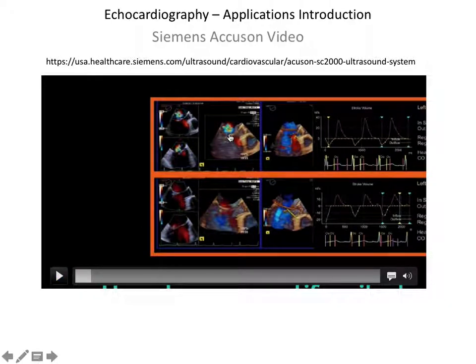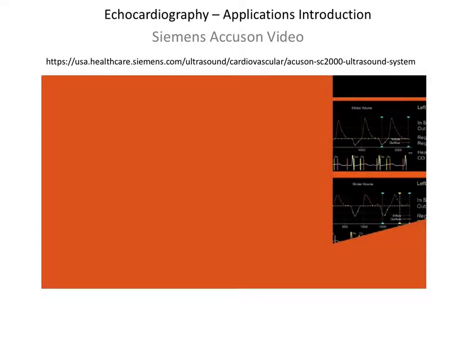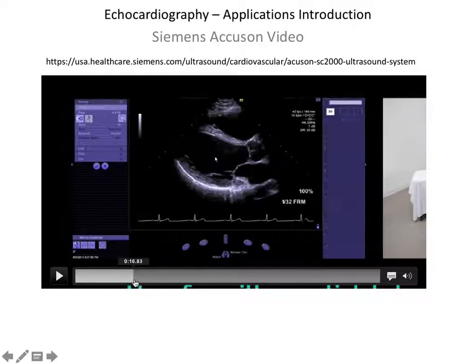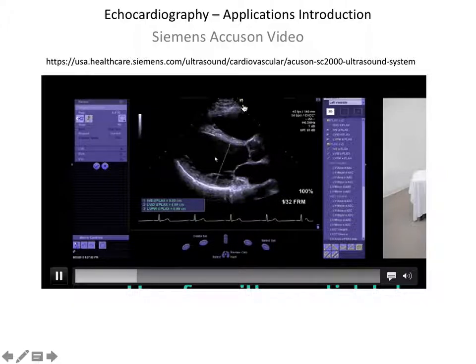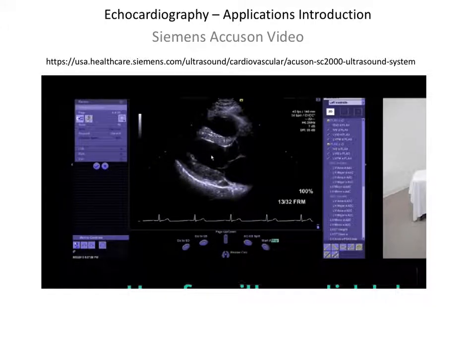And then on 3D, you see the valve plane here with the blood, with the Doppler data superimposed on top of it. So that's pretty cool. That's a pretty nice application. And here we have a classic parasternal view, measure dimensions very accurately to determine cardiac function.